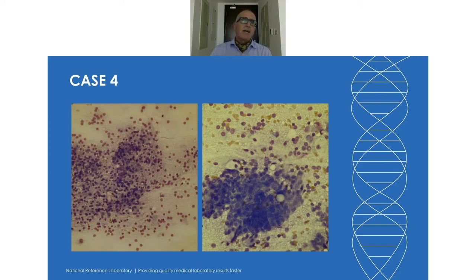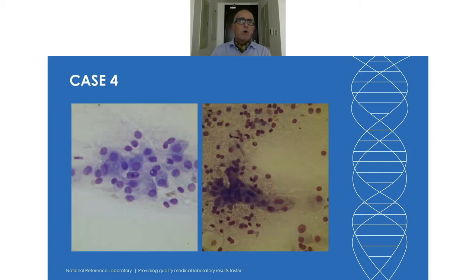cells are either pretty dispersed with very fragile cytoplasm, but then there were groups with a denser cytoplasm and very aggregated, and there was also some mucoid filaments of tissue in the background, as well as cells with denser and in some areas more vacuolated cytoplasm, such as these cells.